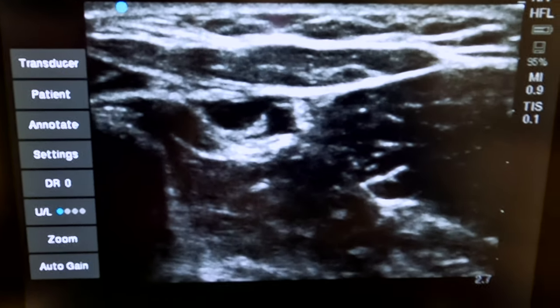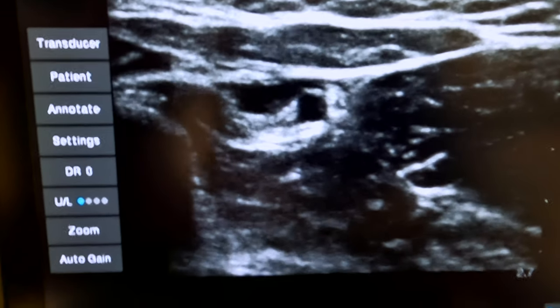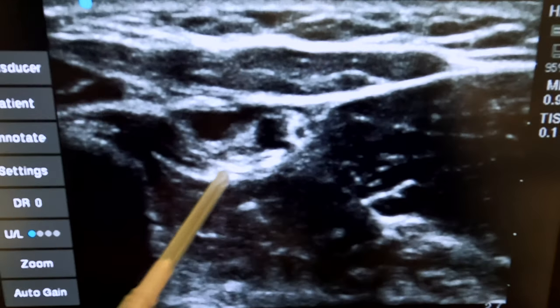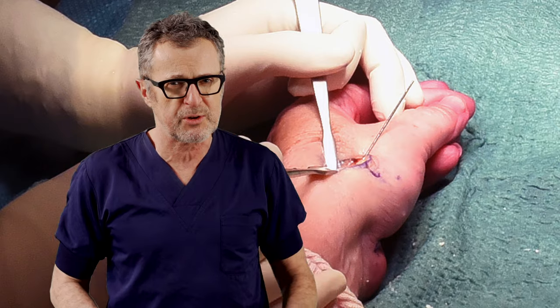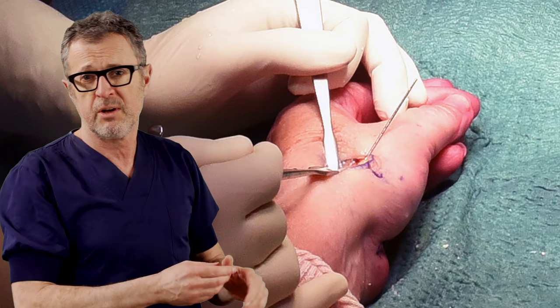Every time we inject, the pool expands. This was a technique for blocking the distal sensory branch of the radial nerve, providing anesthesia or analgesia after surgery on the dorsal aspect of the hand, fingers, or thumb.